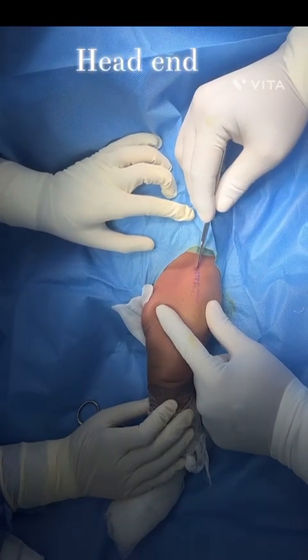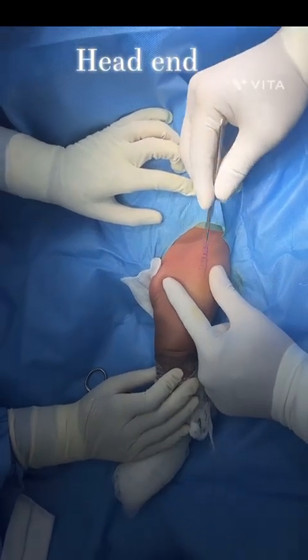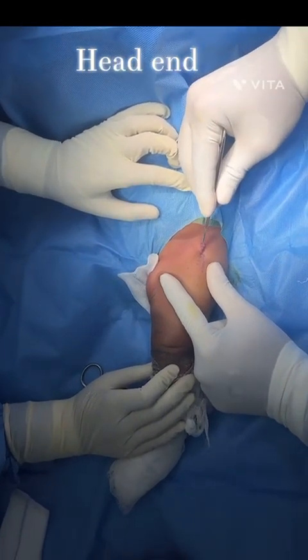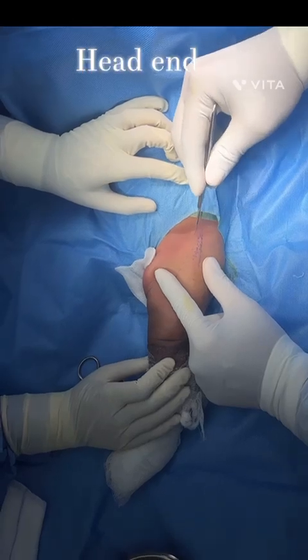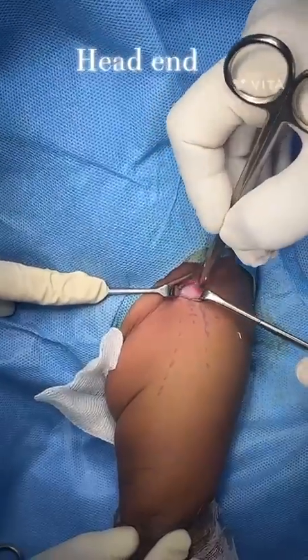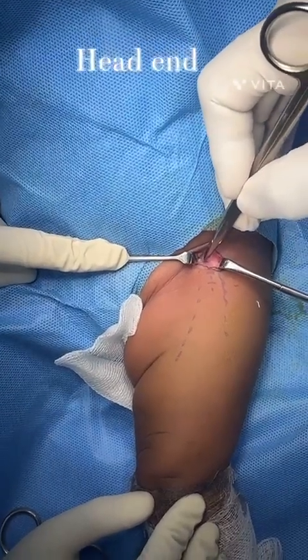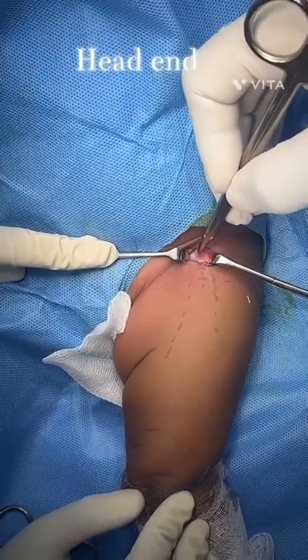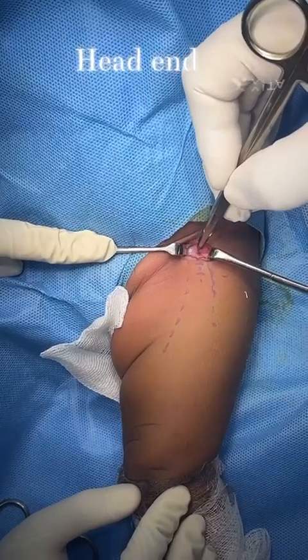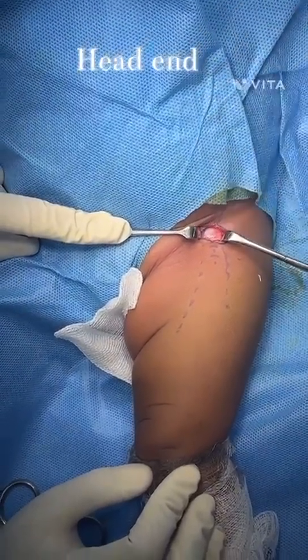This is the tip of ASIS, and the incision will be in the line of ASIS, about 1 to 1.5 centimeters. So this is a plane between sartorius medially and tensor fascia lata laterally, and we can see a small step here which helps us to find the plane between sartorius and tensor fascia lata.